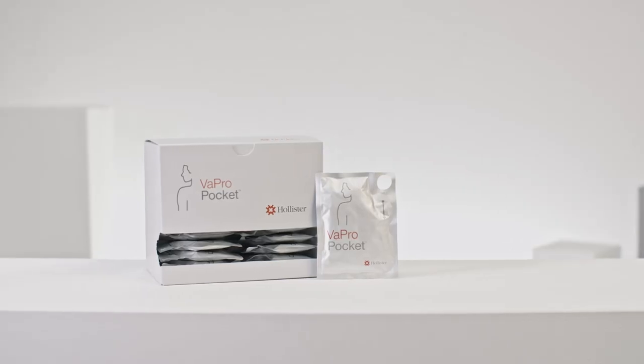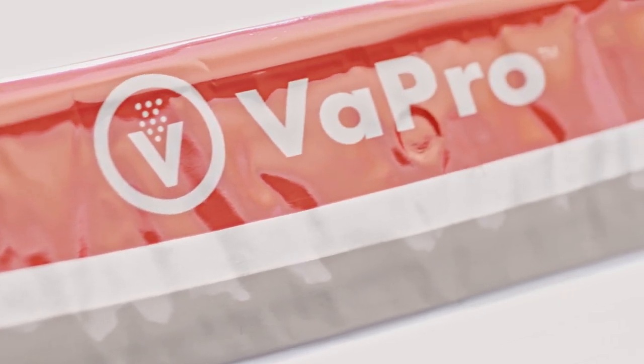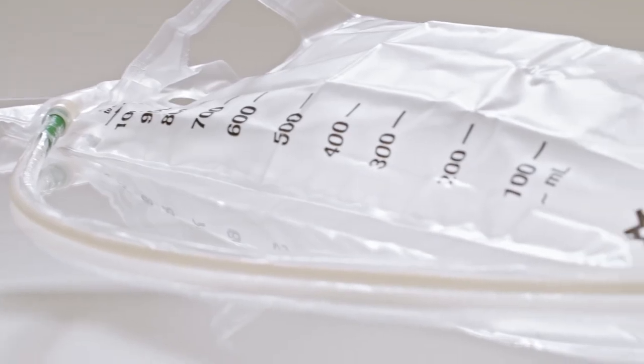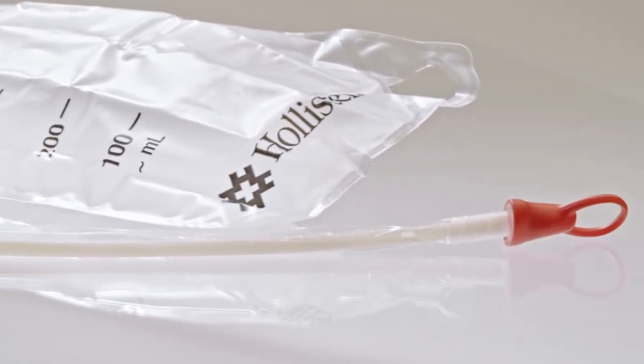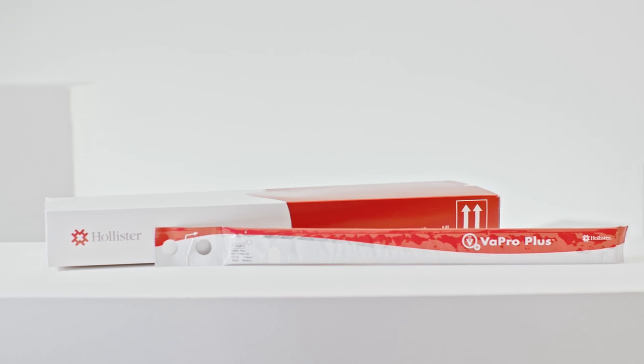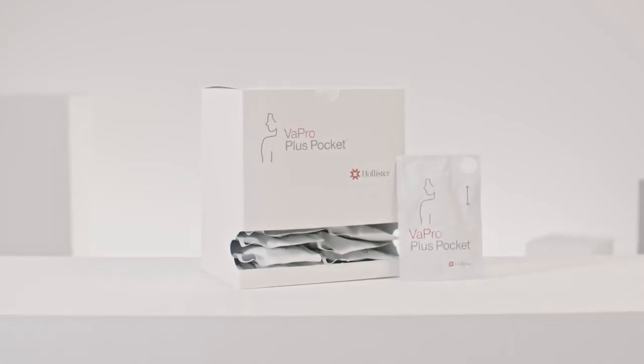Vapro 100% no-touch protection is available in a broad portfolio: Vapro, Vapro Pocket in a smaller packaging, and Vapro F-Style for men who prefer a firmer catheter. If you use Vapro with a collection bag attached, you have the same options: Vapro Plus, Vapro Plus Pocket in a smaller packaging, and Vapro Plus F-Style for men who prefer a firmer catheter.